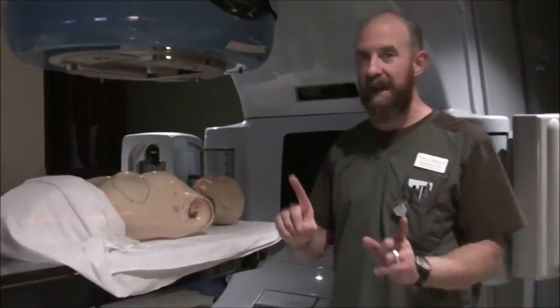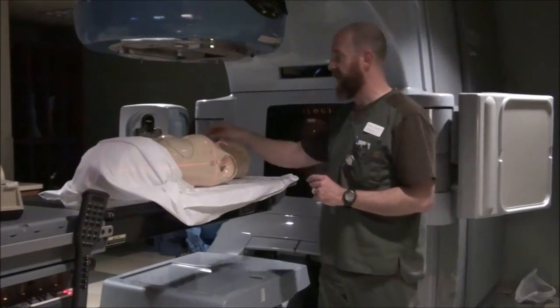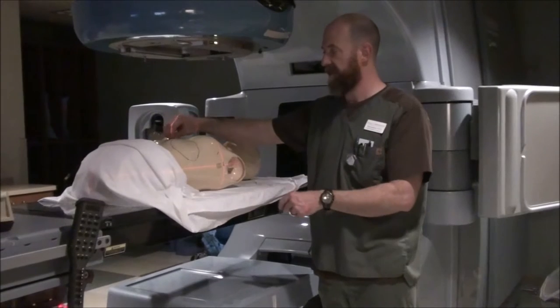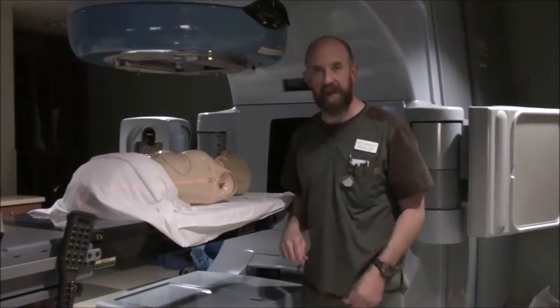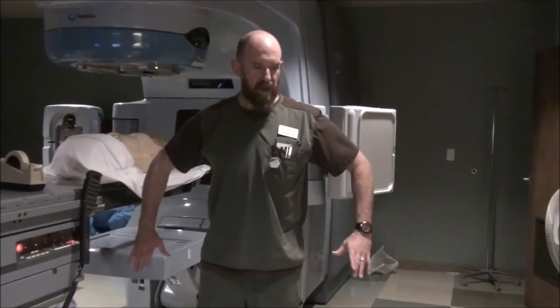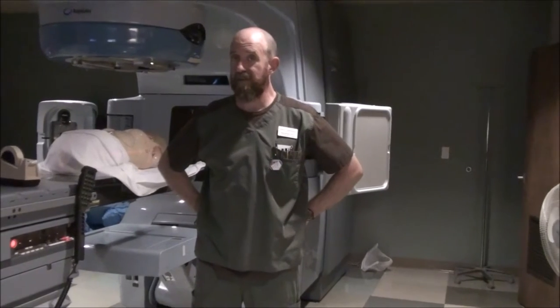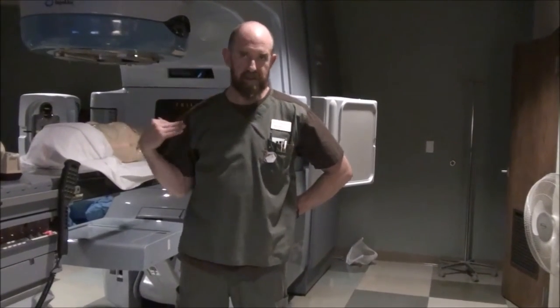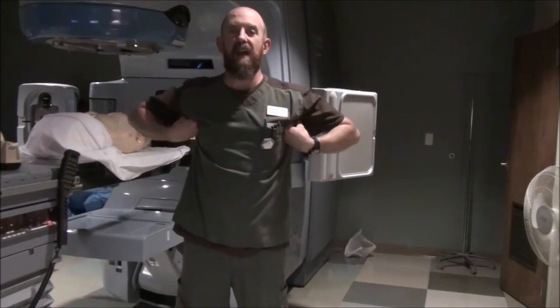That's the biggest thing for your lung. Now, what's different about a mantle from a lung? Almost all of these same things are going to take place except the field is going to be much larger — up on the patient superiorly from where you are now — and you're going to have the arms down instead of up. The patient is actually going to be akimbo: fingers tucked kind of behind the hips, arms out, which opens up the axillary area so you can treat it. You're treating lymph node chains — all the way up to the submandibulars, cervical, mediastinal, supraclavicular, and axillary — all the way down to the diaphragm.